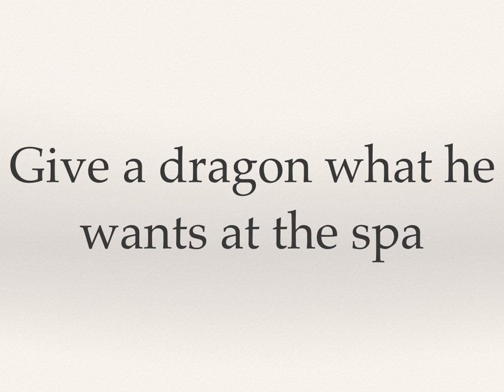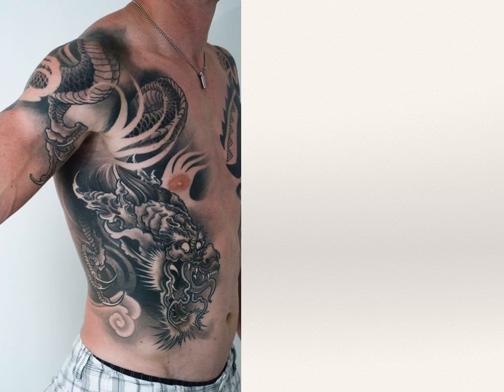And so this is the idea. Let's say this were actually your dragon in the spa, right? So if you're just going to scan longitudinally, whether we're doing a FAST exam or the extended FAST, if we were to go completely linear, or cut right through as a coronal, if you look at that dragon, he's going to be pissed off because you've taken out one of his talons, you haven't trimmed the beard, and you've cut the hair short. Whereas if you were to just rotate a little bit to be more in line with the ribs, you leave with a happy dragon. See, that made absolutely no sense.